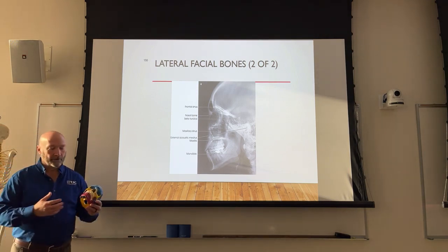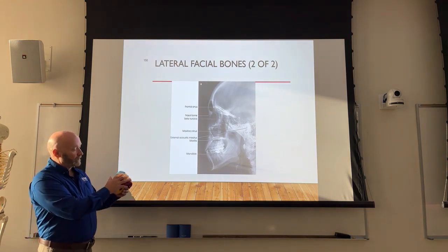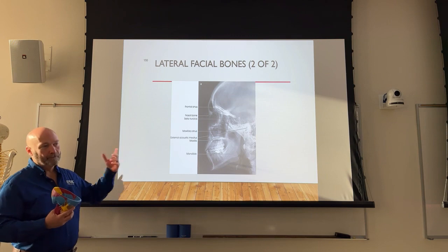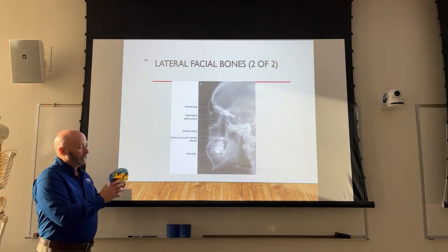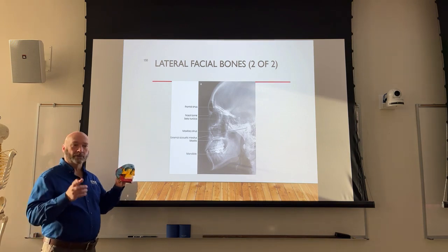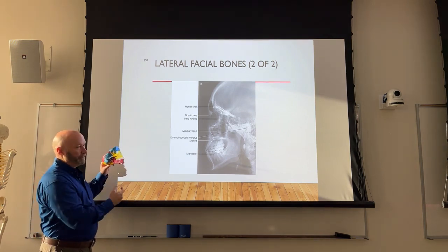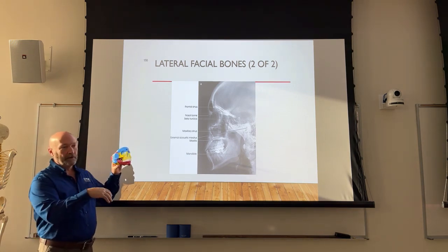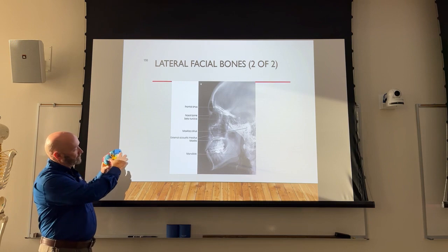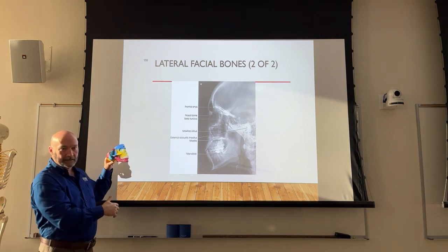through a grid. So what you would do for nasal bones, and I know nasal bones aren't technically on this test, but we're going to go ahead and talk about them real quick because oddly enough, I think there is a question on the test. So what you're going to do for nasal bones is tabletop. That's number one, positioning lateral, just like everything else. Tabletop, and you're going to center to a point about 3/4 of an inch below the nasion.